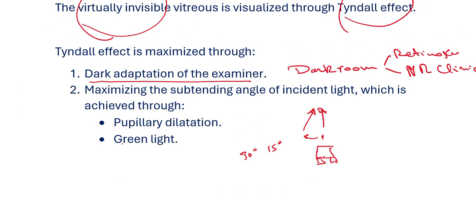Number three is green light, and there are some machines deploying green laser light to maximize vitreoretinal interface examination.